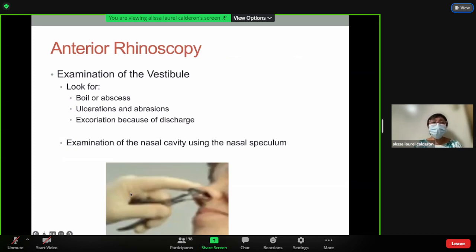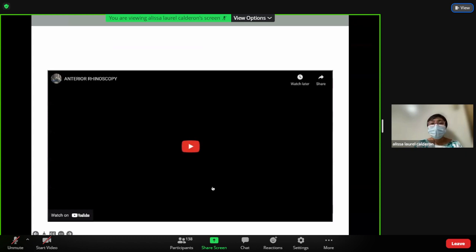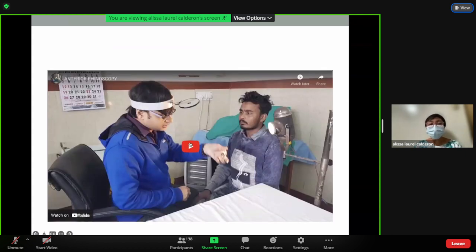So how to go about your anterior rhinoscopy? You use your nasal speculum. Okay. So how to go about it? You put the speculum in the nares, on the vestibule. Check if there's boil or abscesses, if there's ulcerations and abrasions or excoriation. Okay. So let's do it again.